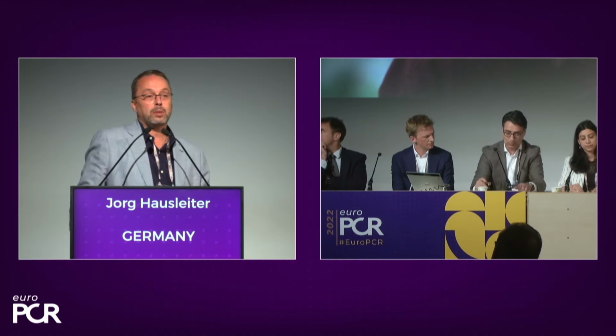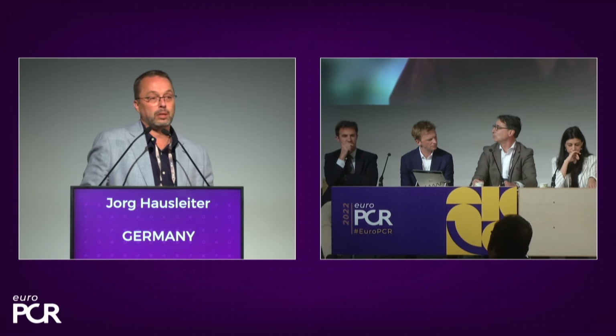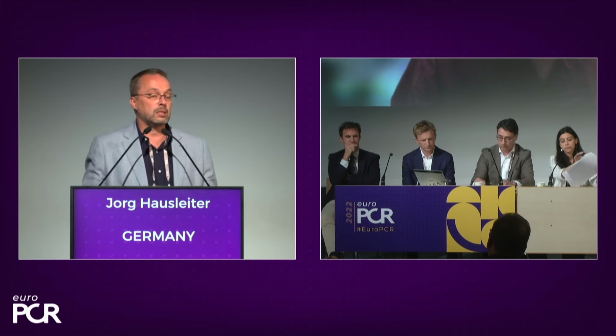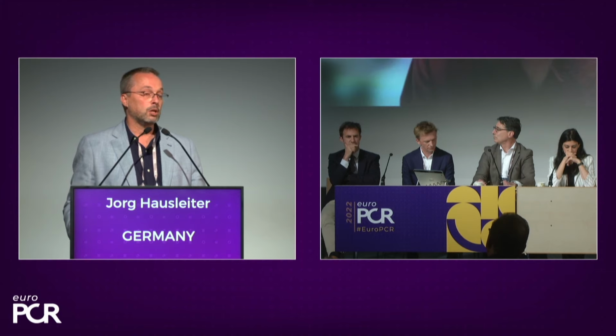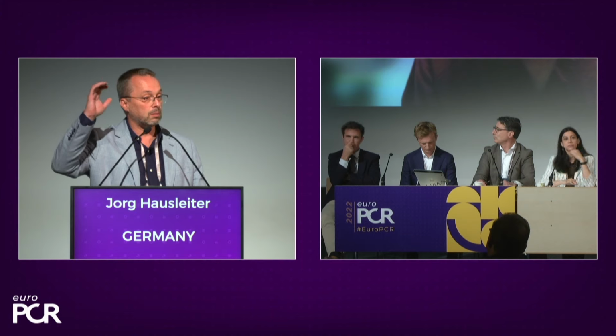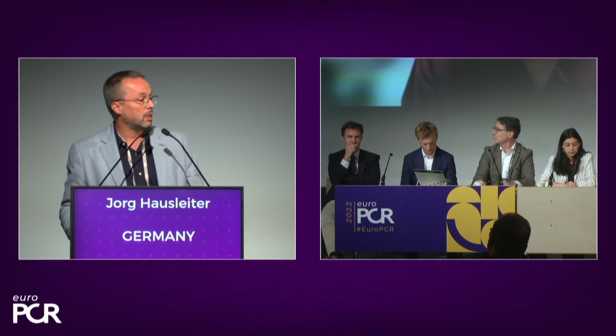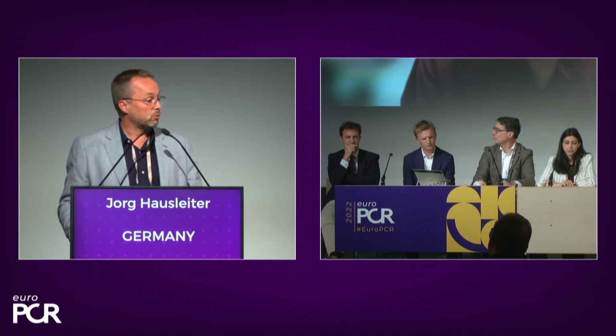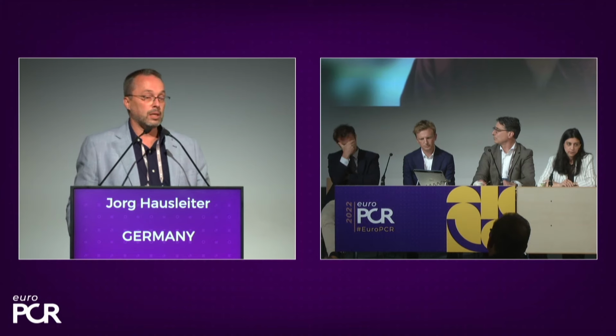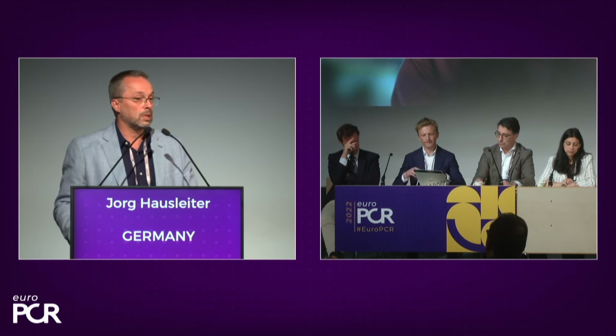Very important questions. Probably each component is interacting with the others, so that to really dice out which is responsible for what is at the end difficult. Let's say, for example, if you look at SLDA rate, SLDA might be associated with the flexibility of the device, but it can also be associated with the orientation of the clasping, the hooks, more or less. It can be also associated, of course, with the imaging, and imaging between a nitinol and a more or less cobalt chrome device might be also different. So I don't think that at the end we can dice out which difference is responsible for what, but those randomized comparisons will help us to understand if the two systems are really comparable, or if one system might be better than the other, or just for some indications better than the other.